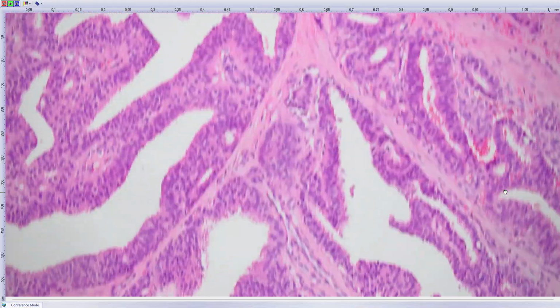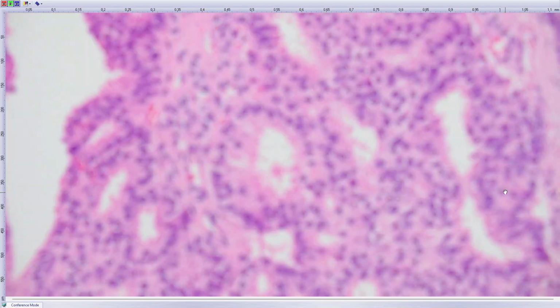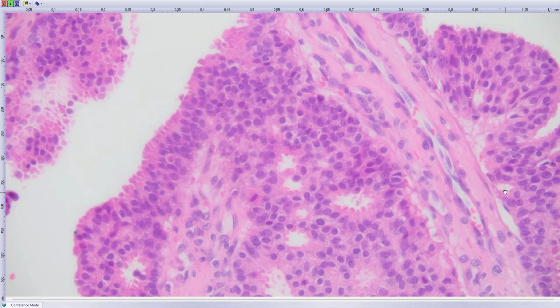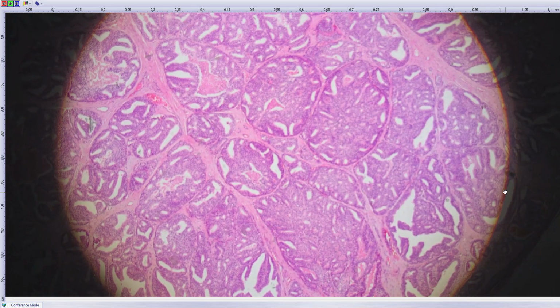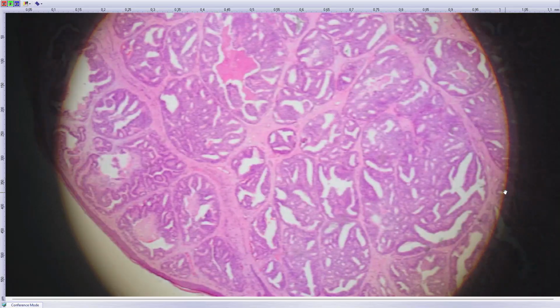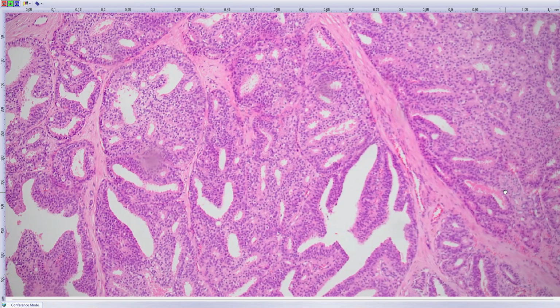the surface of the glands, yeah. So the confusion with apocrine type skin adnexal tumor is very great, yeah. But it's quite common, this apocrine differentiation in one type of carcinomas. Can you guess it? I showed one case in the past. When you see this architecture, you might get an idea. You should get it into your eye.